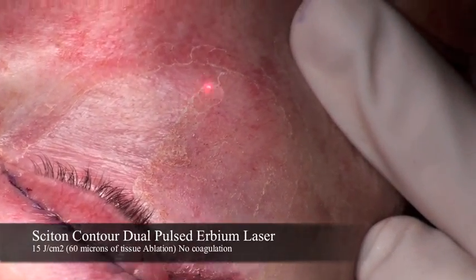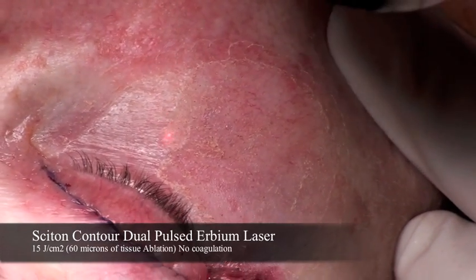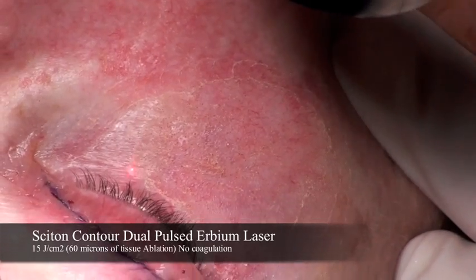This laser can also be used with a computer-generated pattern to apply the laser energy.